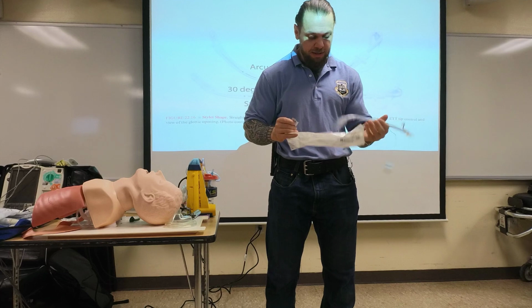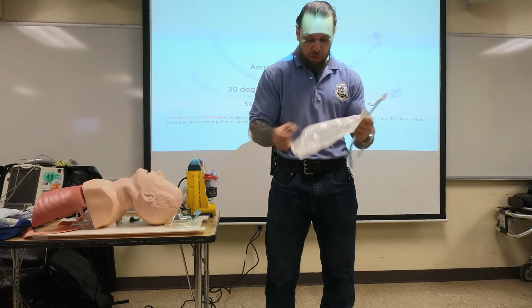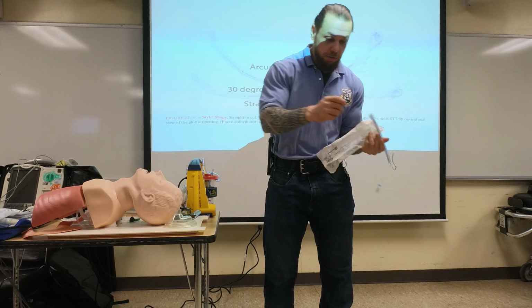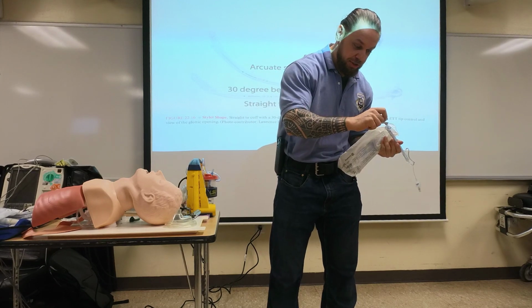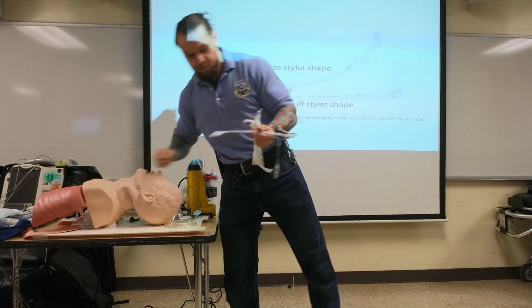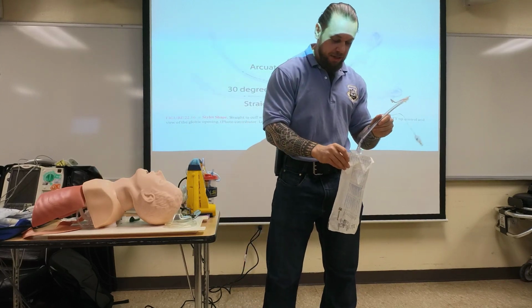And then if you needed to put water-soluble lubricant on it, I would do it again while it's in the packaging. You could open it up like so, and you don't need to dab a lot. You don't need to put it all over it. You just need a little bit at the bottom, and then I usually have it in the package.